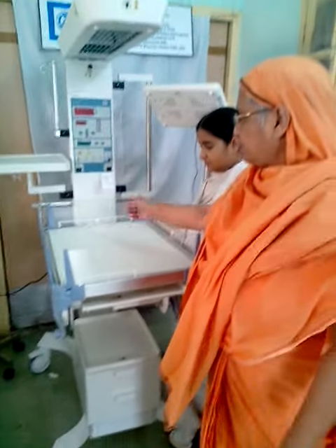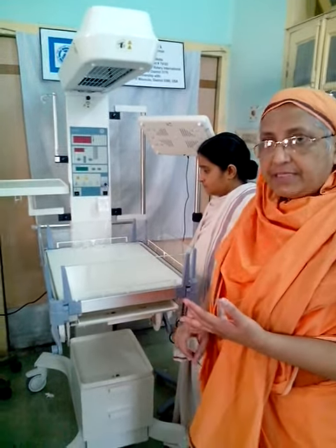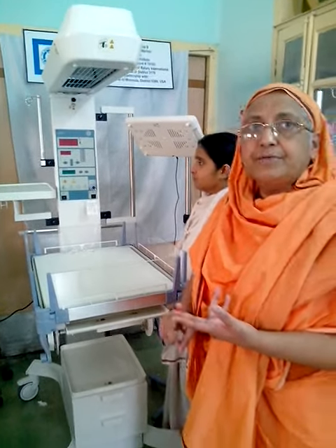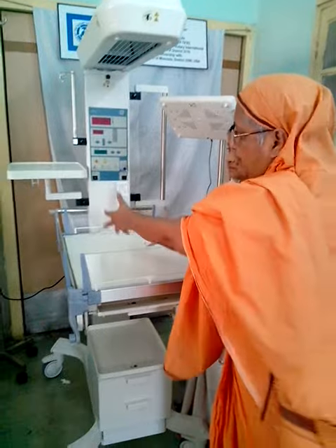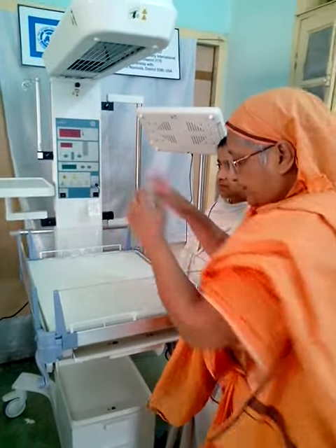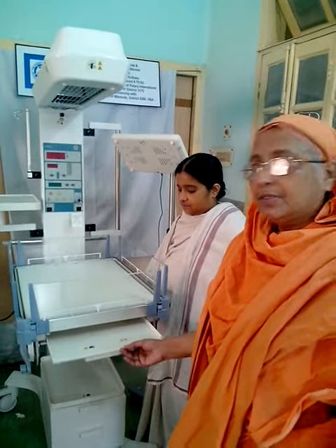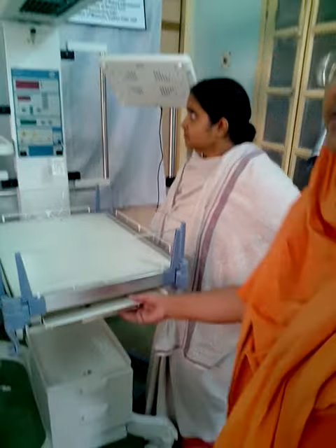Because what happens — a sick baby has a drip, a ventilator, or a CPAP. Then you would have to take all that out, put the X-ray underneath, and place the baby back on top. Instead of doing that, you put it here, so you don't disturb the baby at all. These are the advantages. It is expensive.